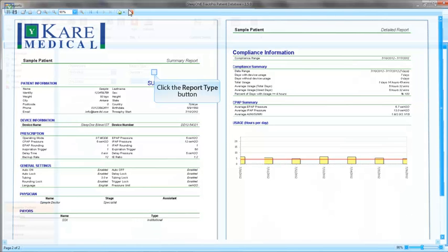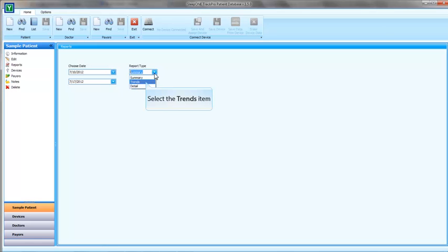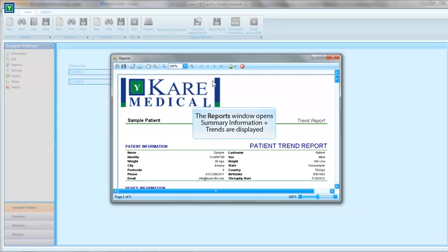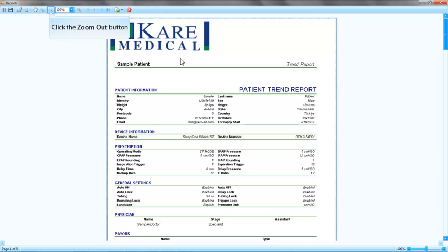Now let's have a look at the trends report. Trends report gives the averages of the patient during the selected therapy time. Trends report covers also the summary report. In the beginning of the trend report, you will see the summary report as an introduction.